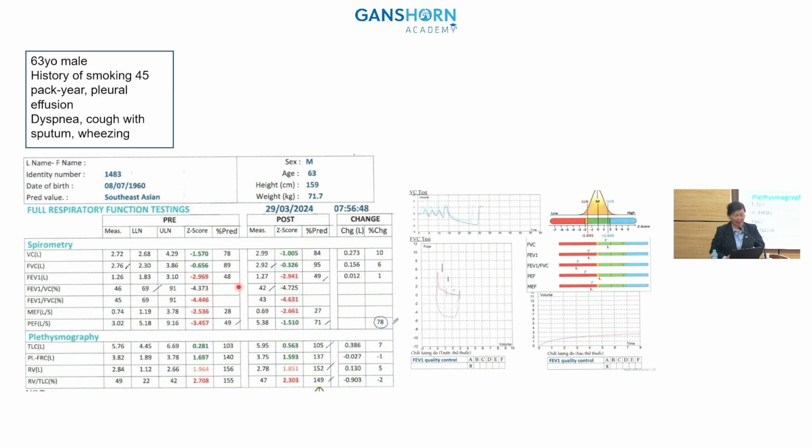Could you decide right at this stage, asthma or COPD? Could be COPD. What is the next step? Well, we check the TLC. Yes, go to the box.